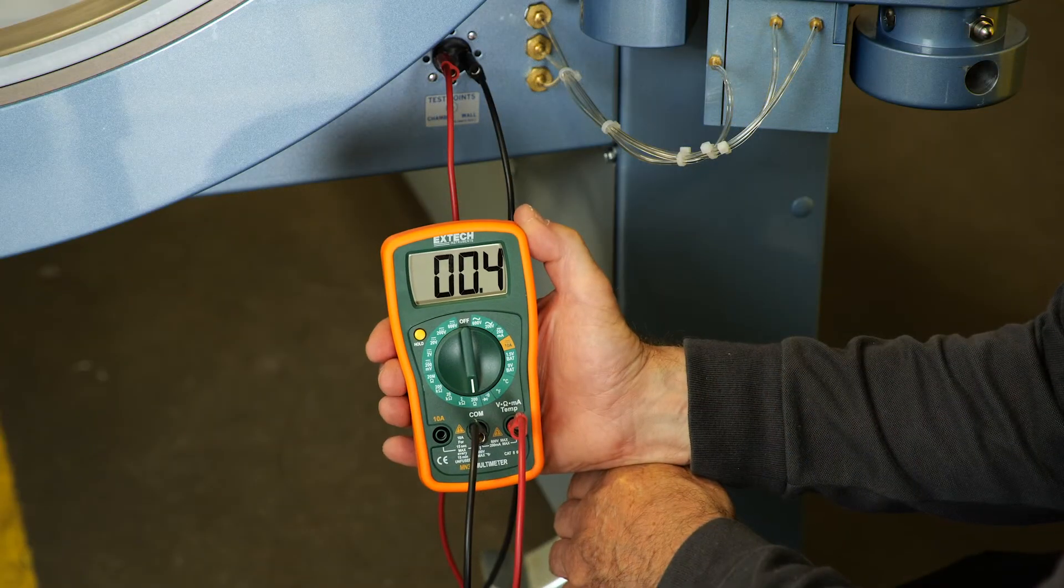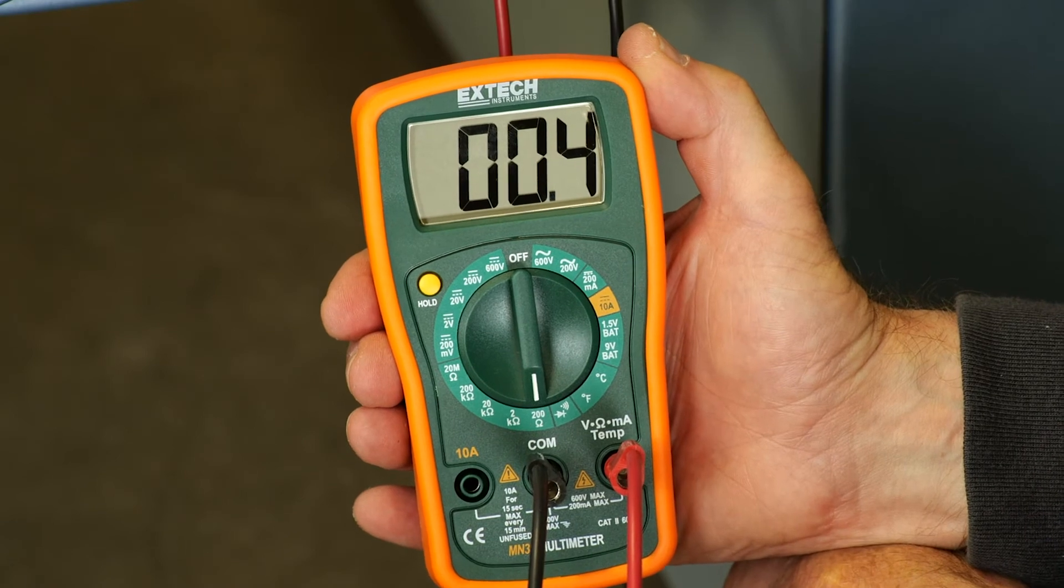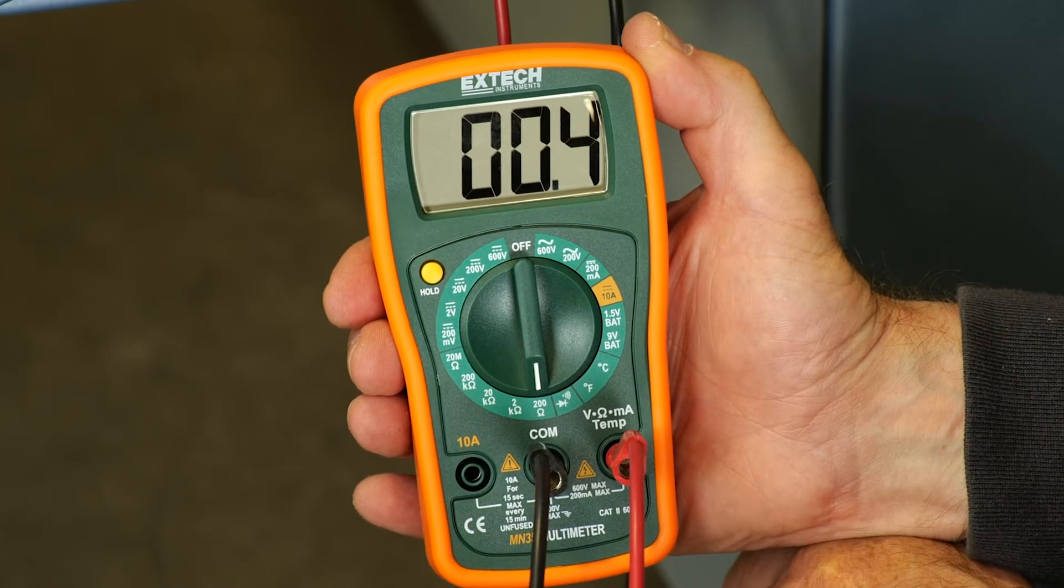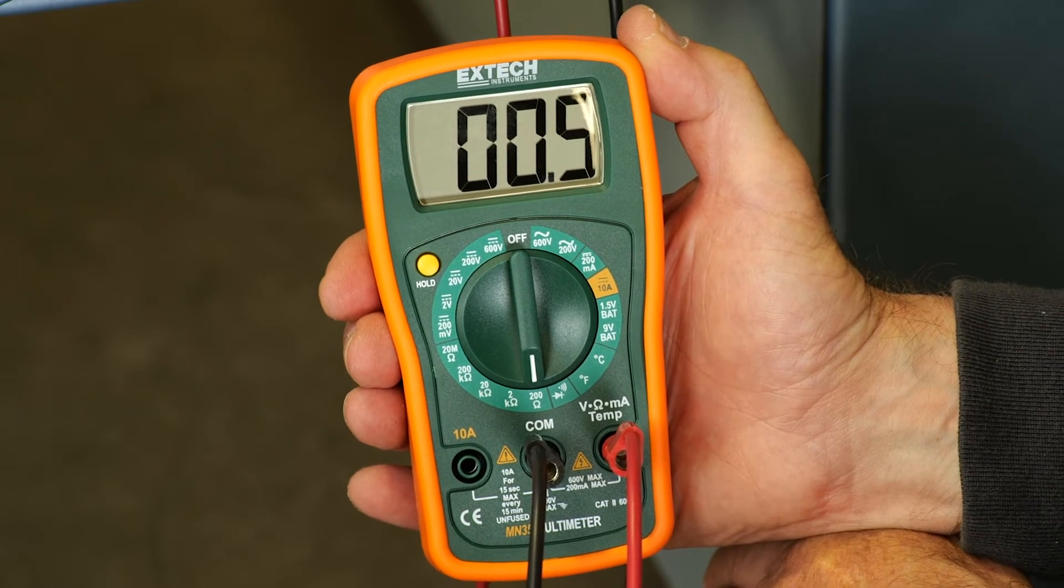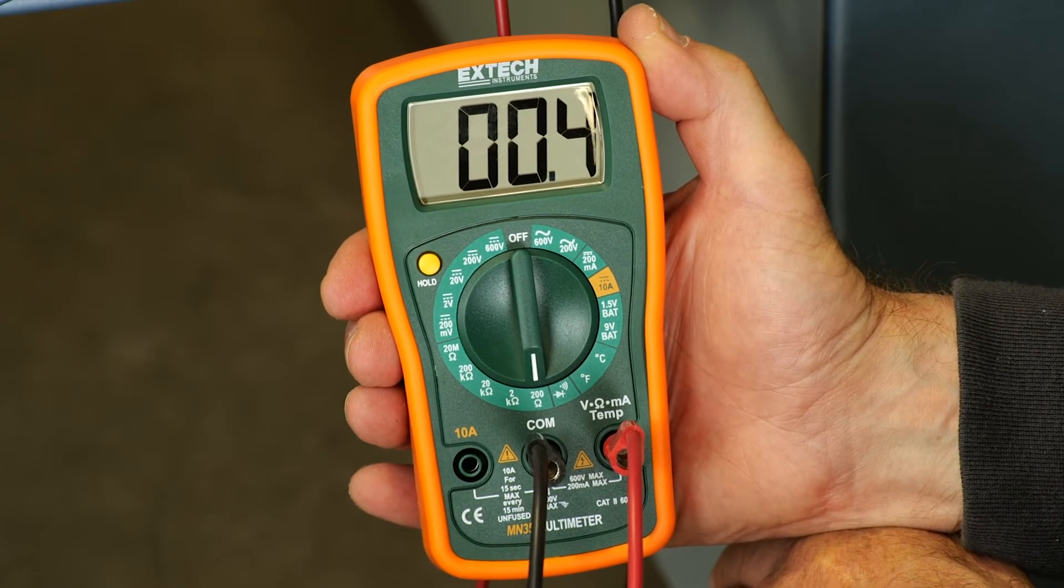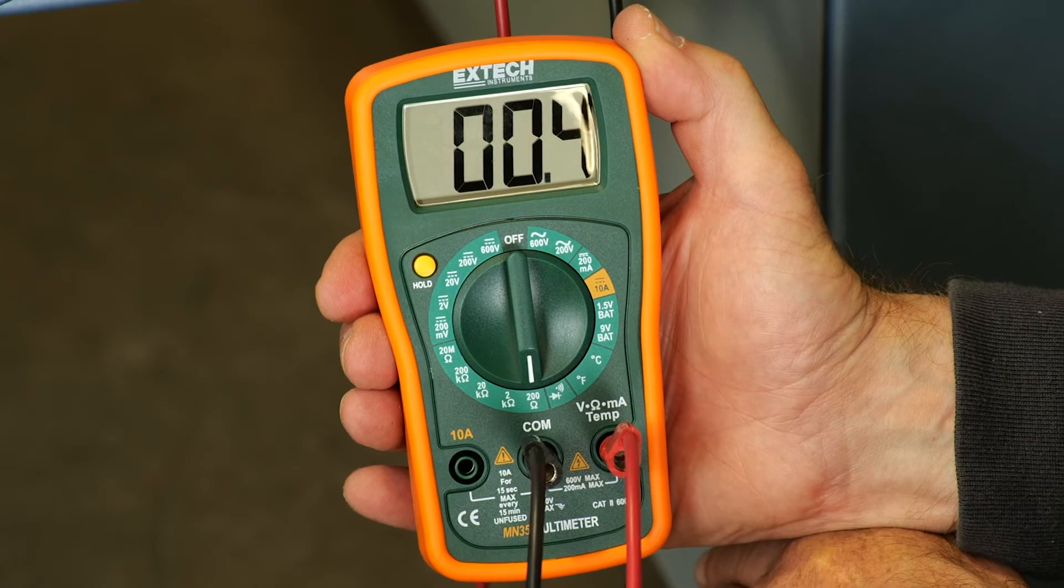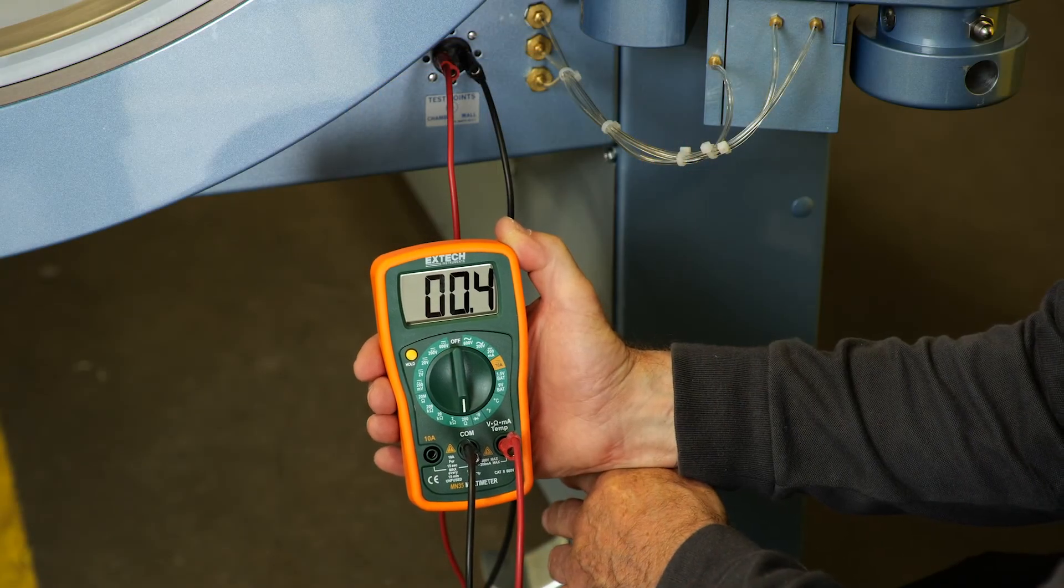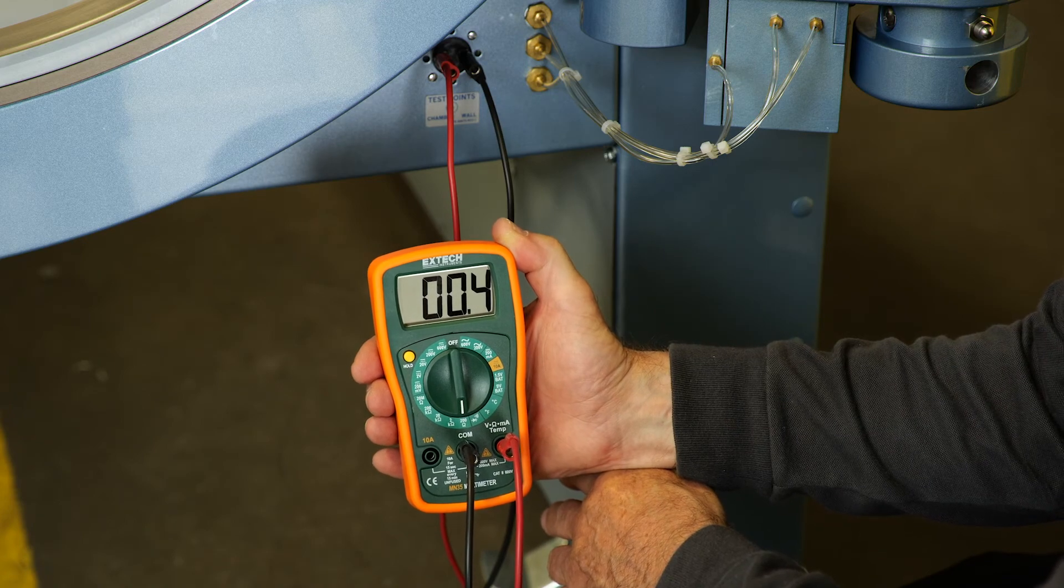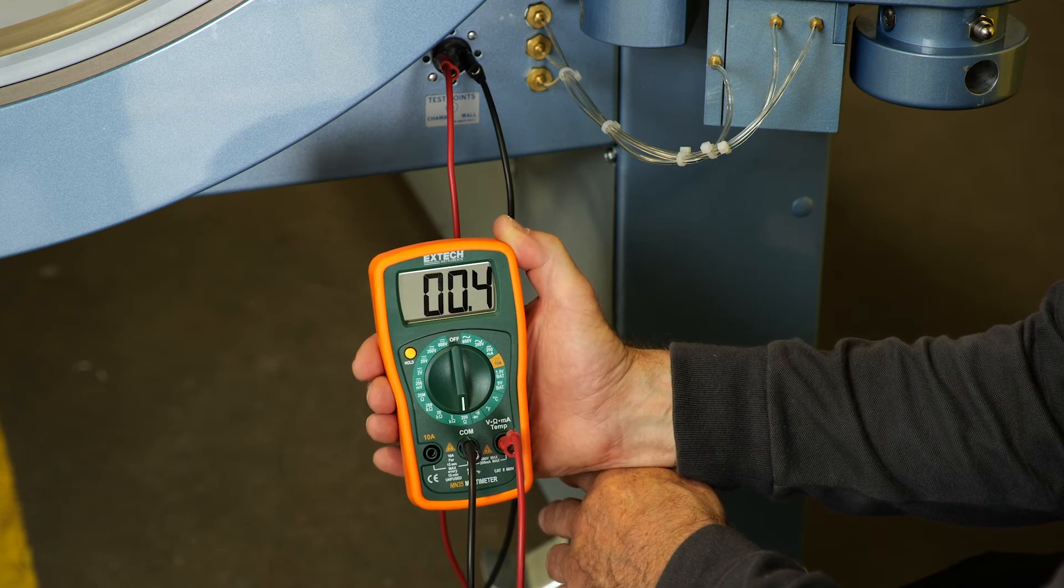You want to set the meter for the lowest ohm scale. I'm using the meter that comes with the Seacrest test kit, and that scale is 200 ohms. If you're using your ohm meter, it may be less or a little bit more, but you do want it on the lowest scale for ohms. The reading on the ohm meter should be less than one ohm. The reading we have here is 0.4. That is excellent.